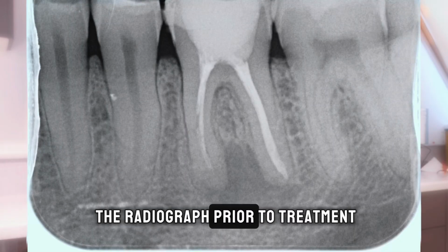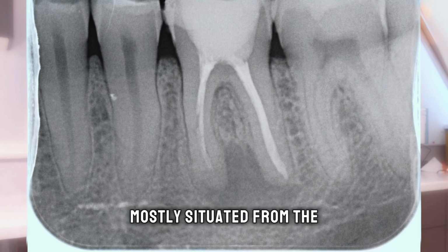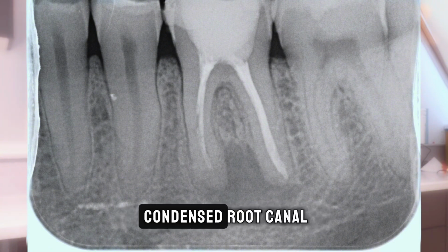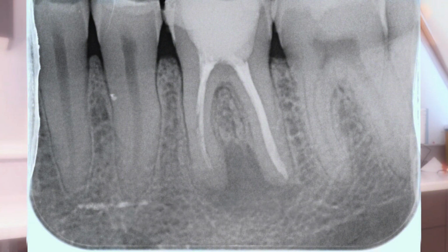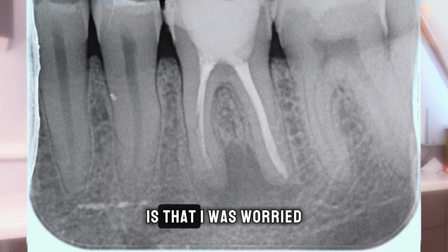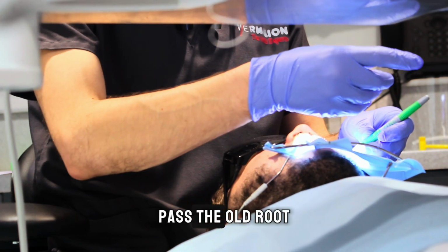You can see on the radiograph prior to treatment that there is a large apical radiolucency on the end of the tooth, mostly situated from the mesial canal, but extending towards the distal. There is a poorly condensed root canal filling in the mesial canal, which is short of the radiographic apex. The challenge I was expecting when I saw this x-ray is that I was worried we may not be able to gain patency in the mesial canals because there's no obvious canal past the old root canal filling.